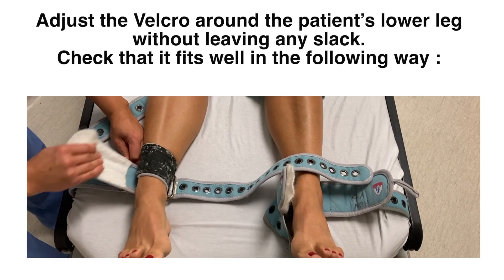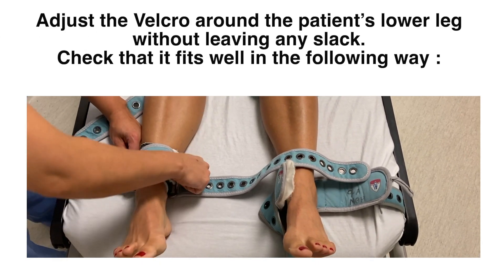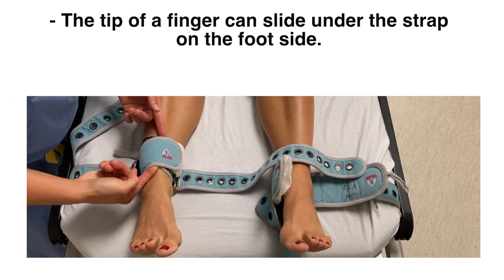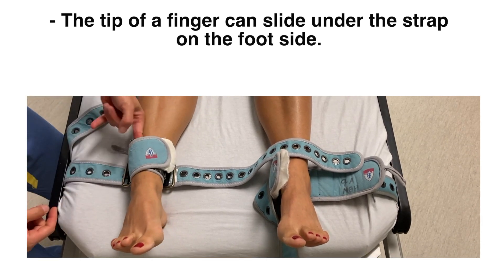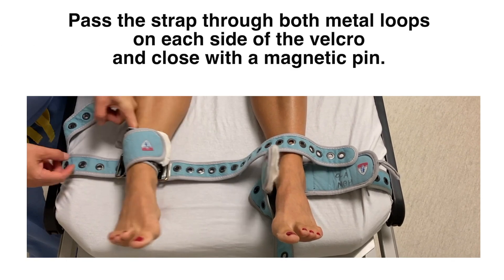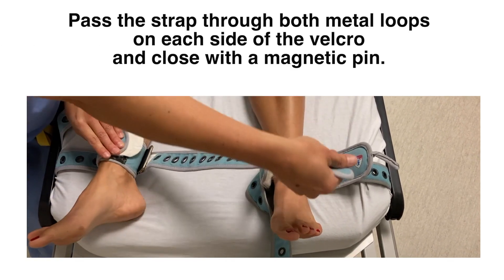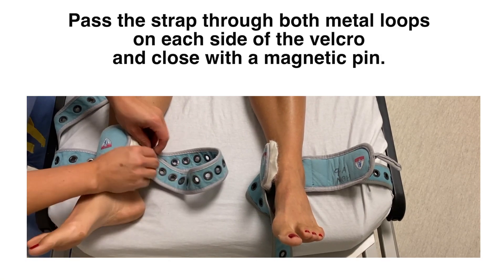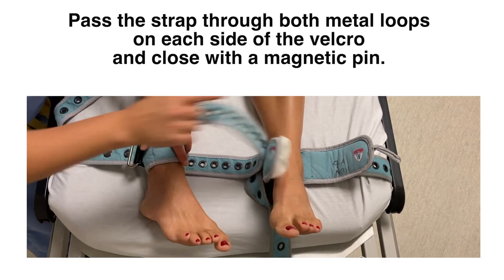Adjust the Velcro around the patient's lower leg without leaving any slack. Check that it fits well: the tip of a finger can slide under the strap on the ankle side, and one finger should be able to slide under the strap on the knee side. Pass the strap through both metal loops on each side of the Velcro and close with a magnetic pin.